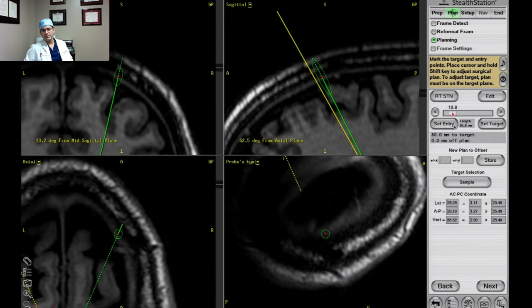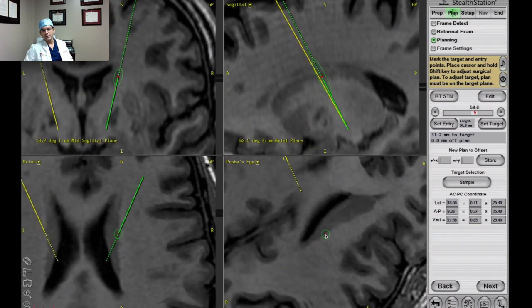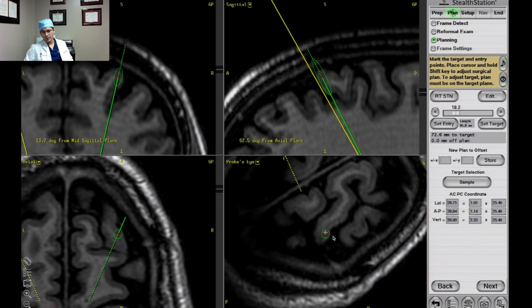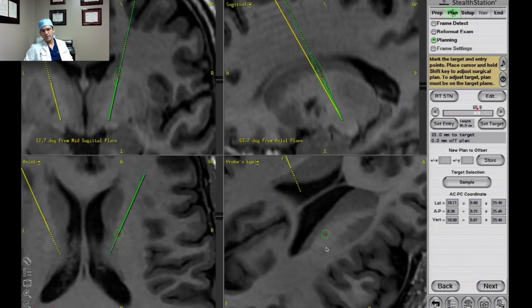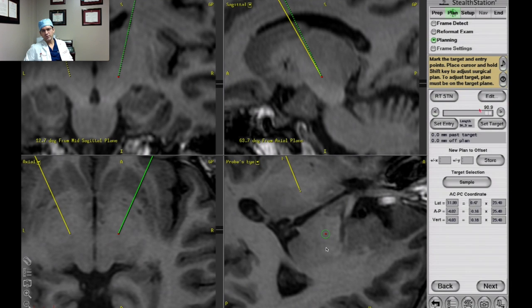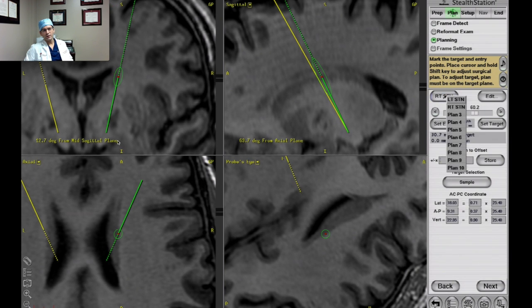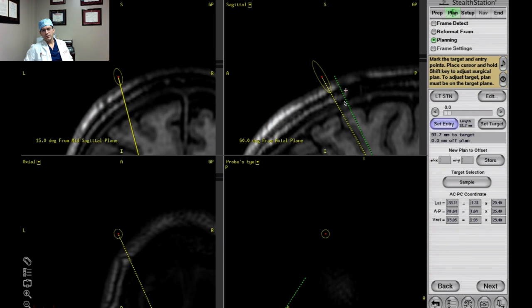I can reset my entry by clicking 'set entry.' What I'm looking at here is making sure I'm not going into a sulcus, finding a good gyrus, and looking at the coronal suture. In my practice I like to go right at the coronal suture or maybe just a little bit anterior — I don't go posterior, and I do not go significantly anterior. You can see as I'm adjusting my trajectory what's happening to our sagittal angle as well as our angle from the axial plane. I've found a trajectory for the right; now I'm on to the left.